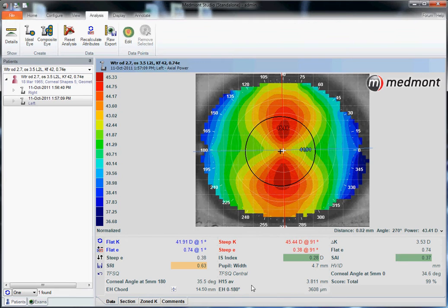In other words, if our scleral lens is calculated to a diameter of 15 millimeters, we know the estimated height of the anterior chamber. We can then add in the apical clearance, and that gives us the required sagittal depth of scleral lens that we require.